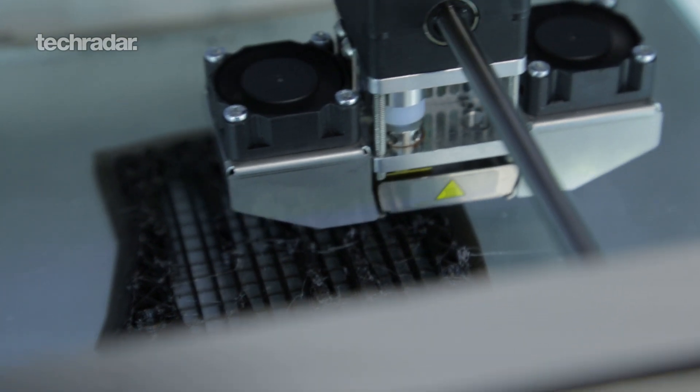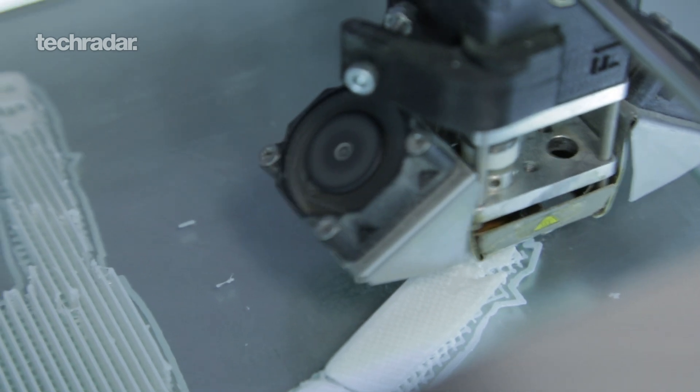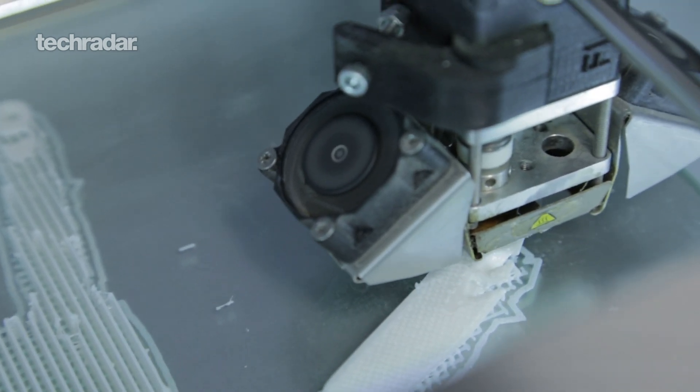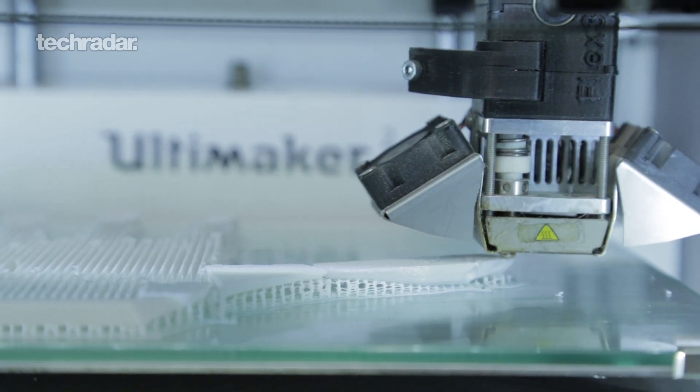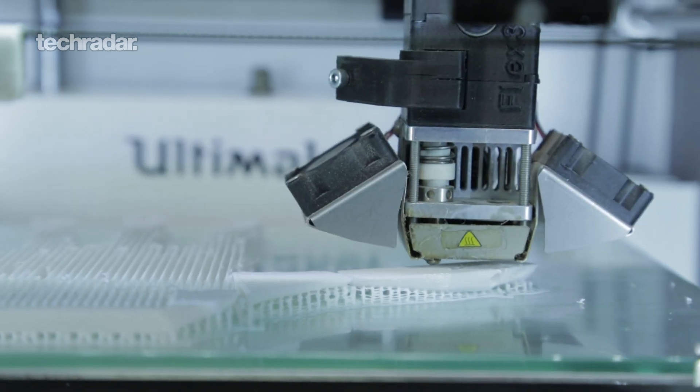It's perfect for one-off manufacture, and prosthetics are always one-offs — they're custom fitted each time. So even though 3D printing might be expensive for high-volume manufacture, if you're just making one-offs it's actually really cost effective.